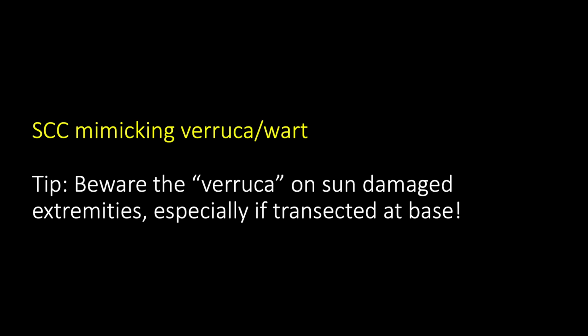And I would say that my lesson here is beware the verruca on sun-damaged extremities, especially if it's transected at the base. Now, I see warts on sun-damaged extremity skin all the time in my practice, and they sometimes get some atypia. I think a combination of sun damage and the viral HPV-related effect on the keratinocytes can make the keratinocytes look kind of bigger and more atypical in warts, especially if they're inflamed.